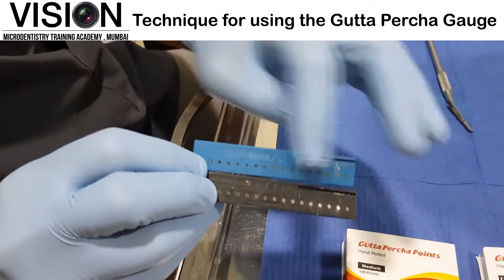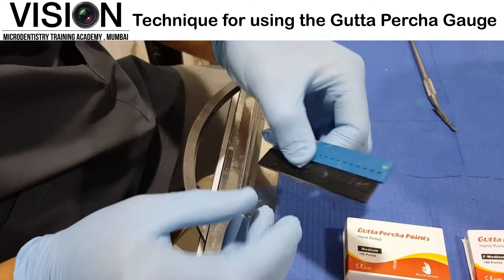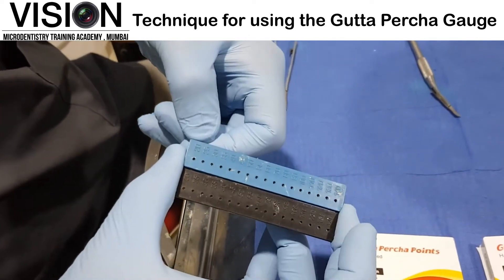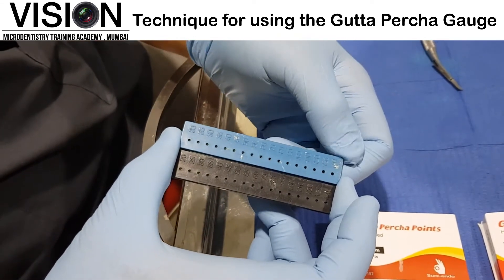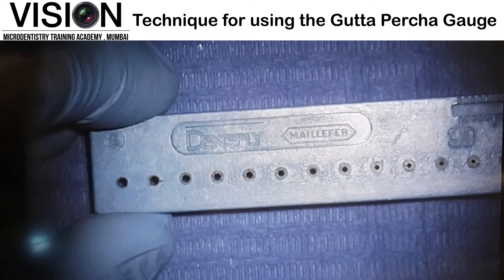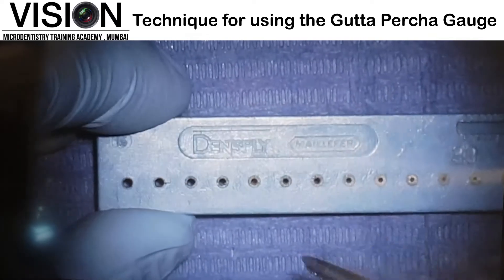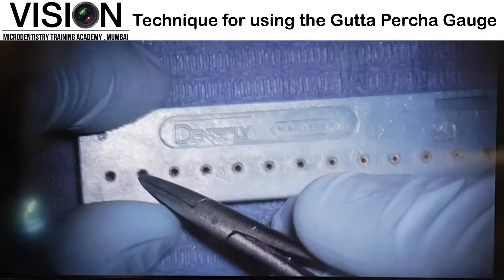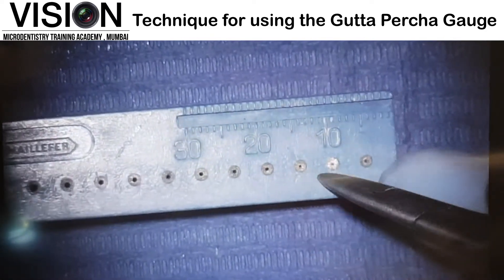On one side, you have different holes and a measuring ruler. Whereas on the other side, you have different numbers which basically denote ISO sizes starting from size 20 up to the largest size. You can see the largest hole is on the left side of the scale and it goes on decreasing in diameter as we move towards the right side.